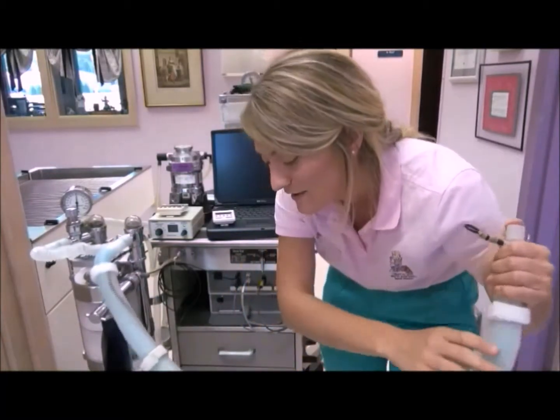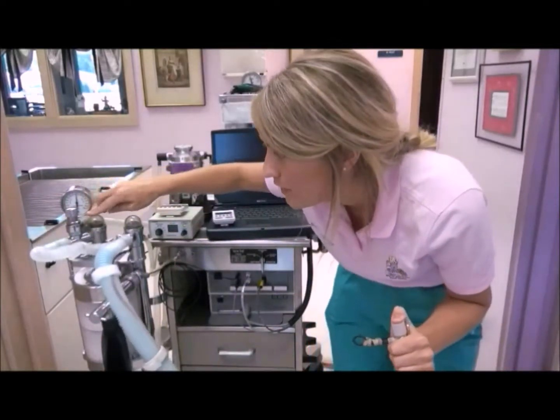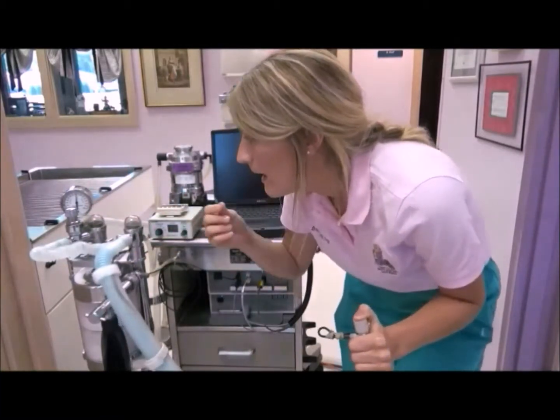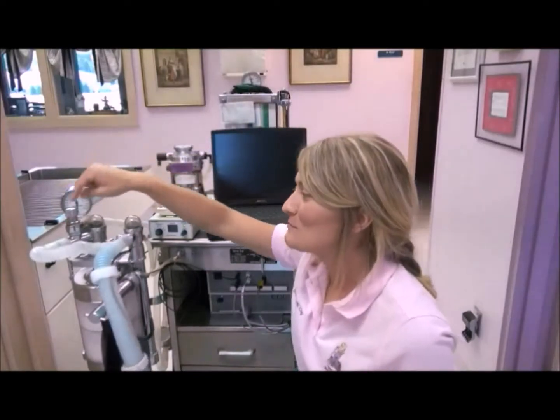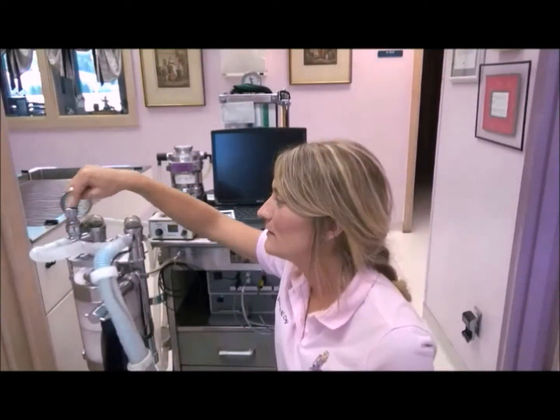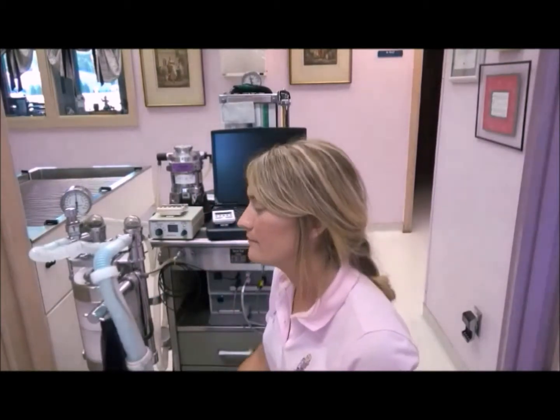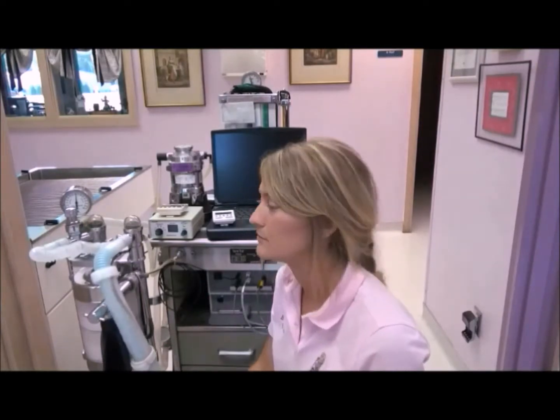But once exhaling, that then travels to the expiratory unidirectional valve. So that's only going to open when they expire, when they let out a breath. This is the pop-off valve here. So it's important that that's always open when the anesthetic machine is going. If it's completely closed, that can really damage their lungs. It can cause the alveoli to rupture.